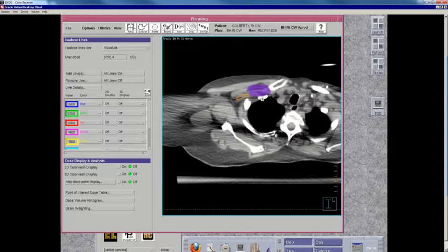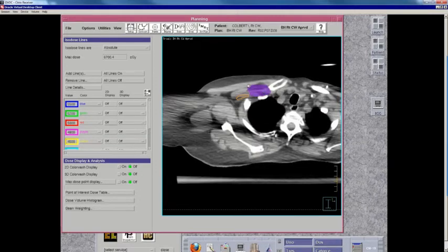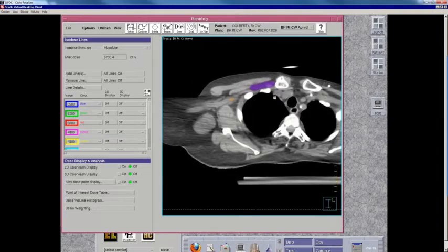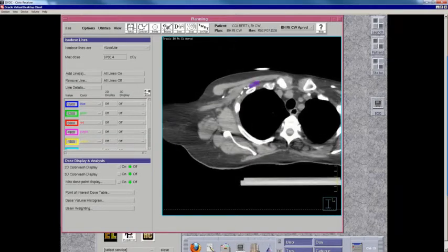So I contour the axillary apex. I remember I pointed out those lymph nodes that we can't really trust the surgeon to remove completely. And so we contour those here, and that serves as a guide. Generally, what I'm contouring is I'm looking to see where the surgeon stopped their dissection. This surgeon left me a lot of clips. I can pretty much tell she stopped right here.